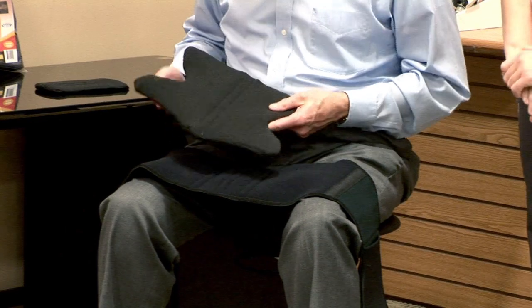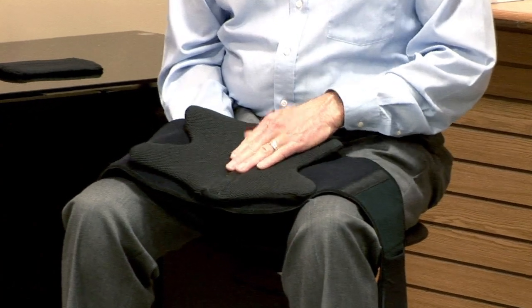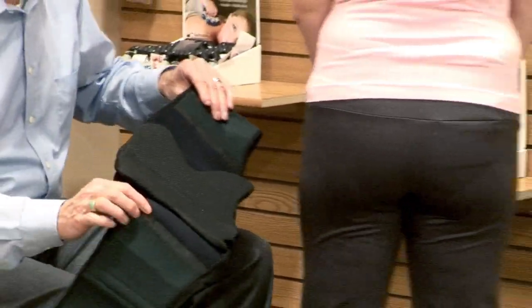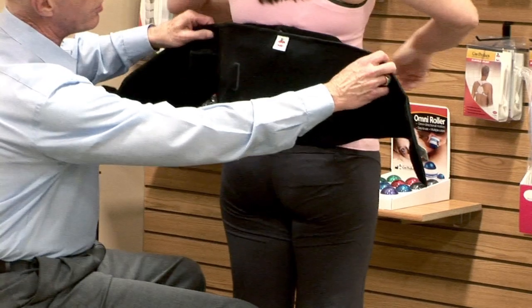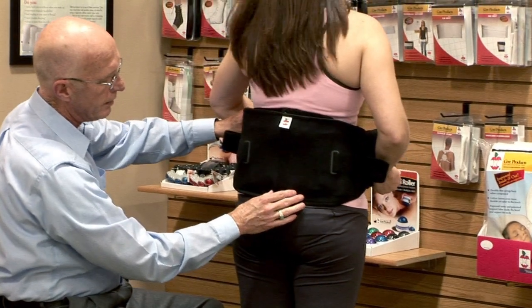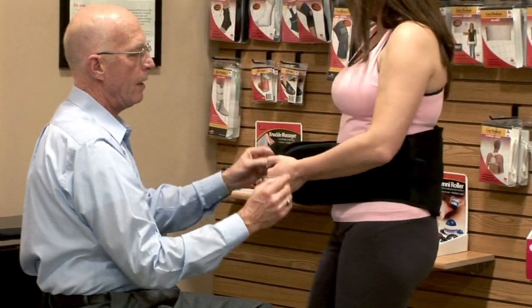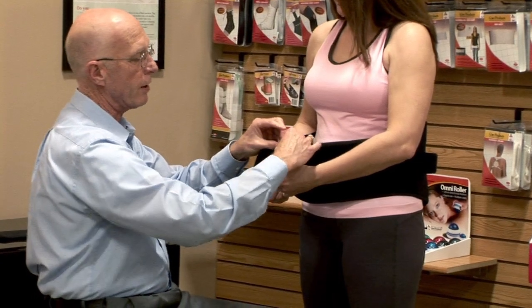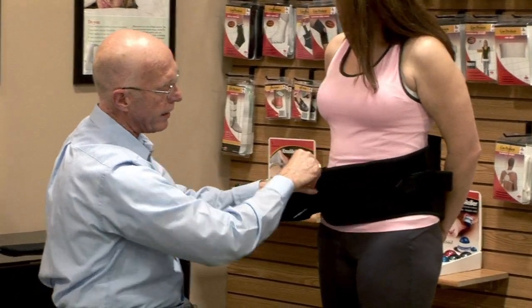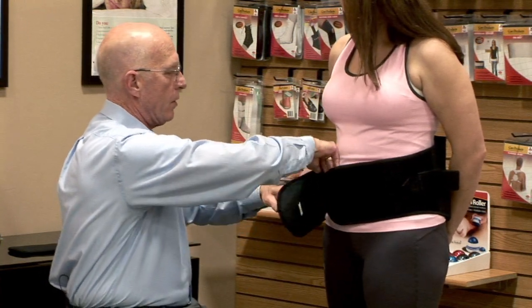We'll start with the post-op or post-injury configuration. Get that aligned, touch the Velcro down, and now we can fit this to the patient. Viewing the patient from the posterior, we usually start high and come down so the bottom of the support is at the level of the distal margin of the sacrum, or at the top of the crease of the buttocks. Make sure it stays square, then come around. There are thumb loops and hand pockets to help with application. Making sure we get it at the right height — the bottom of the support at the level of the symphysis pubis.